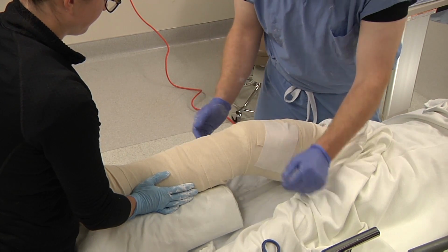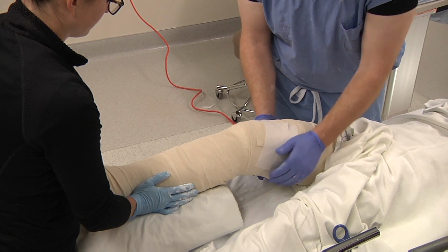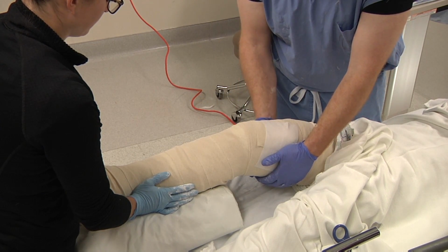You can at any point use C-arm to check your reduction, see if you need to do any alterations.